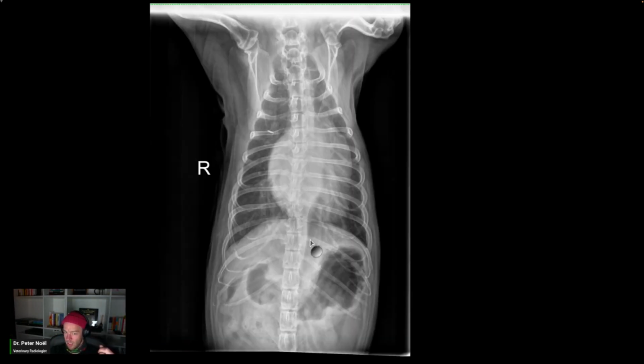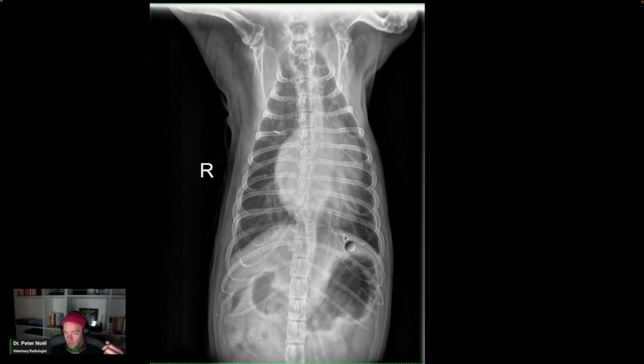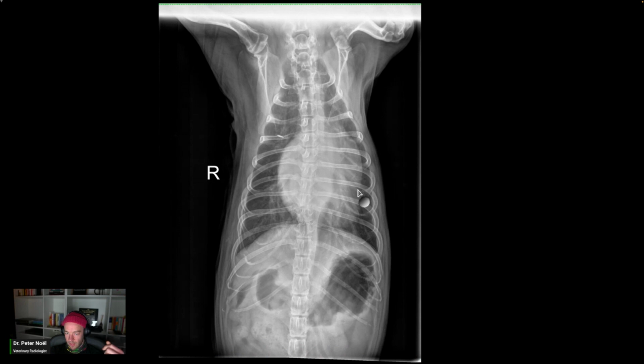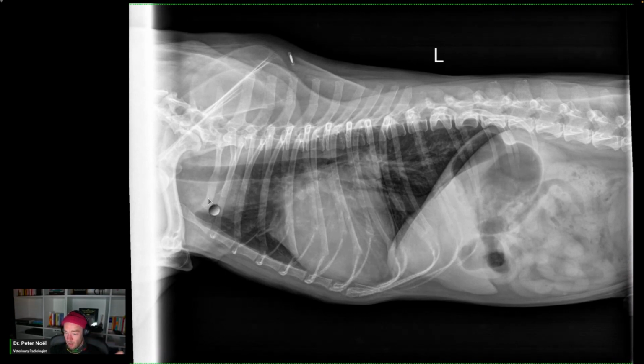Because I'll be honest with you, you don't always get the reverse D. It just doesn't happen. And I would say in this particular case, this needs to be filled in with tissue in the area of the right ventricle, right? So you've got left auricle, left atrium, left ventricle, right atrium. You've got a collection of structures here. You have the aortic arch that comes around and does this. Then the 1 to 2 o'clock is the MPA, the main pulmonary artery bulge, 2 to 3 o'clock is the left auricle. So there's your clock face. The 6 to 9 o'clock needs to get filled in a little bit more. But again, our ability to discern right-sided cardiomegaly and pulmonary hypertension on survey radiography like this, I think sucks.